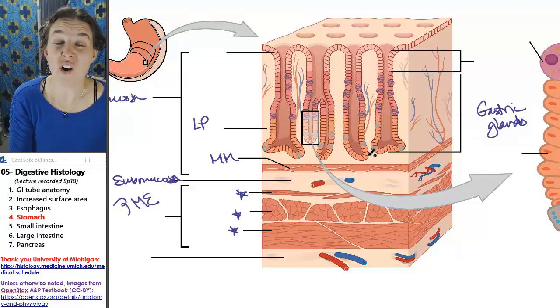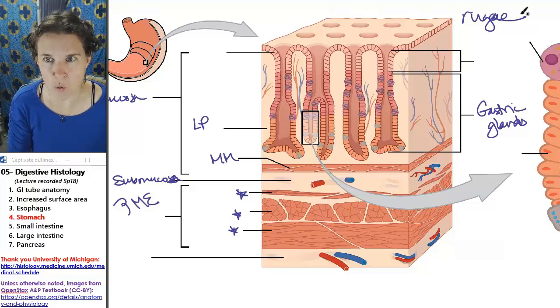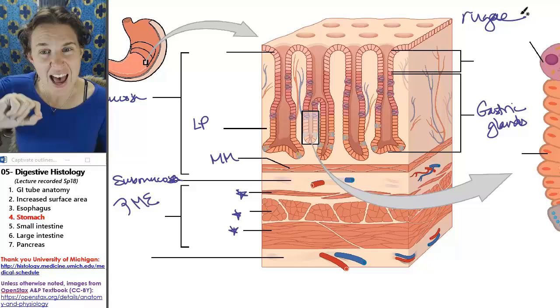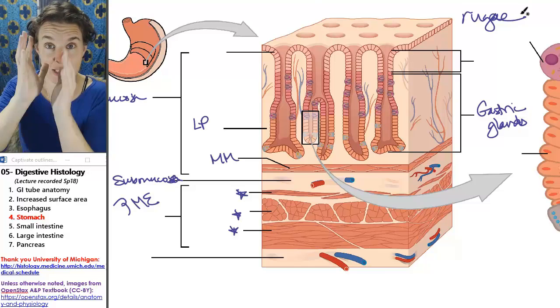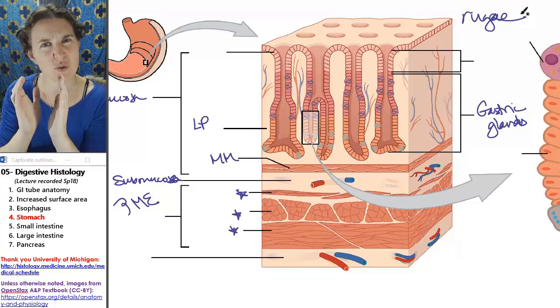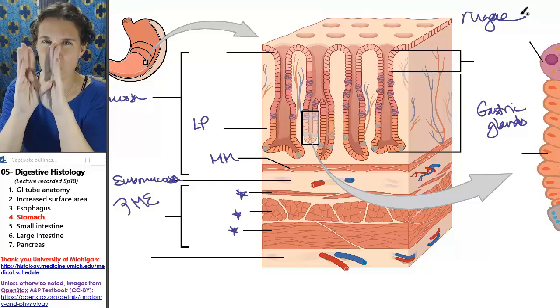One thing is that there are rugae, or what were the gastric folds in the stomach. And that is just those places that will look like extensions up and out. They tend to look a little more square than finger-like, but remember that the rugae were just there so that we could stretch.